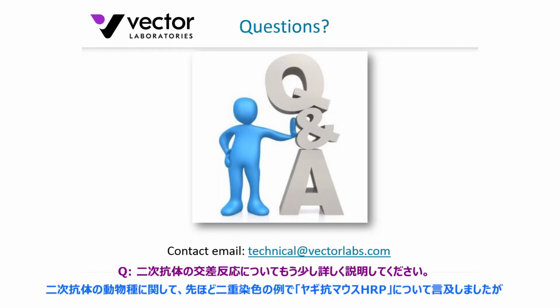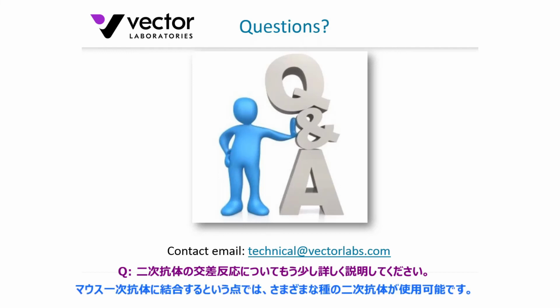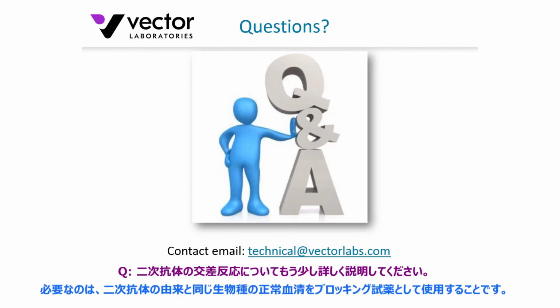In terms of the host species, I did mention a little earlier on, goat anti-mouse HRP, for example. You could certainly use a range of different species of secondary antibody. If the idea is to bind to a mouse primary, you could use a goat anti-mouse, you could use a horse anti-mouse for a single label. It doesn't matter what species the secondary antibody is raised in. And indeed, the idea would be to use serum from the same species that the secondary antibody is raised in as a general blocking reagent. So it doesn't really matter. Just be aware, though, of any potential cross-reactivity with a second or a third primary antibody or detection reagent that you might introduce. Hopefully that answers the question.